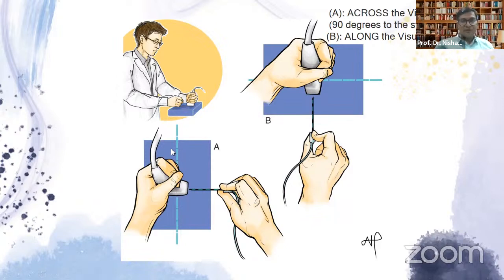So instead of doing this, this is the same axis that we are seeing. If we do it like this, or I stand here and the machine stands here, that will be a better position rather than the needle entering 90 degrees to the student's body. So your needle should not enter at 90 degrees to your visual axis. It should always be in plane to your visual axis.